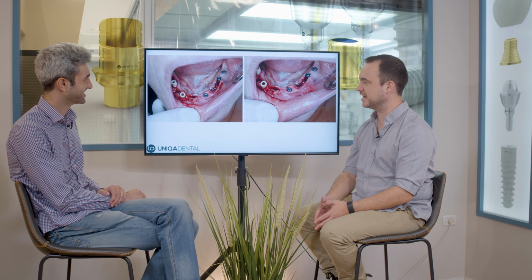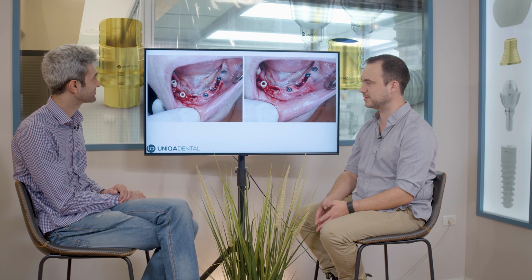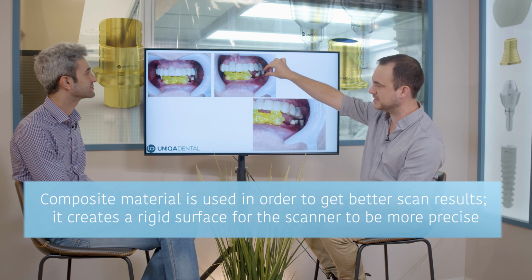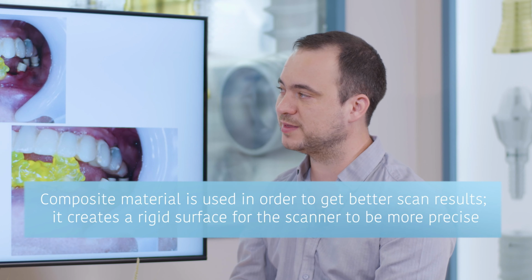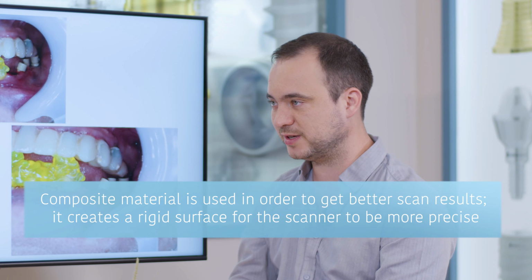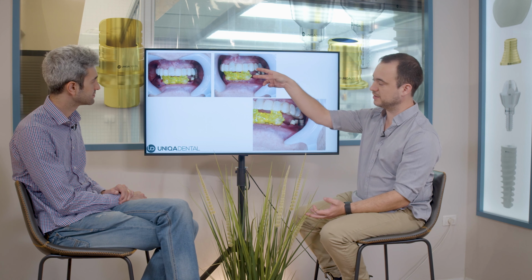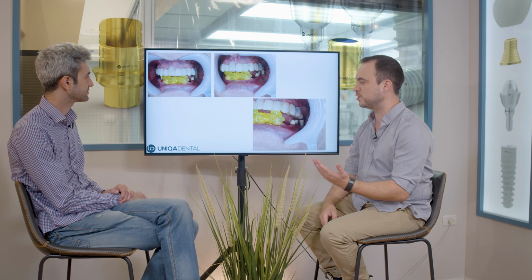Yeah, in here you can see that we took off some of the scan abutments, and we've added on some of the scan abutments composite material. The composite material is in occlusion, and you can see that in this case the height of the scan abutment is exactly 6 millimeters. This is probably the smallest height for the restoration that you want to have. In the anterior part you have much more. You can see the height of the composite material.